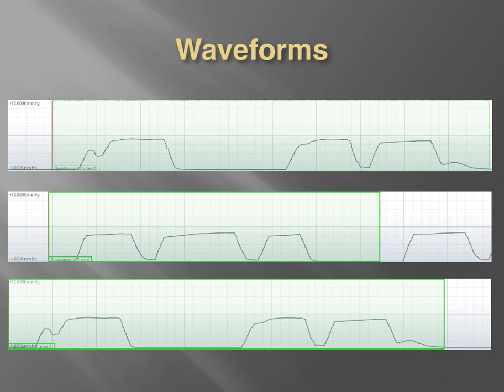Here's another patient that we had post-resuscitation cardiac arrest, and we have this patient sedated. However, we keep on getting all of these little blips in here, and we can see that the waveform is actually relatively normal, except we have these little aberrations. However, the rate is irregular, and the waveform is normal looking, like I said, and the size is relatively good and consistent as well.